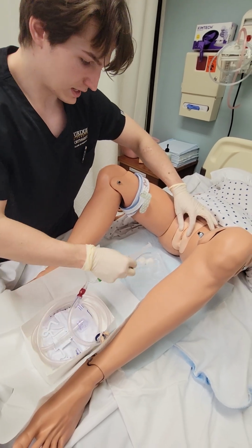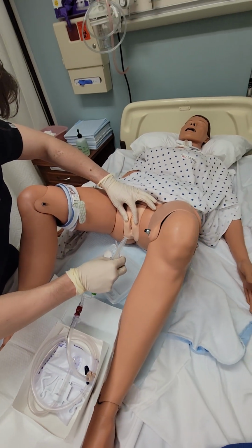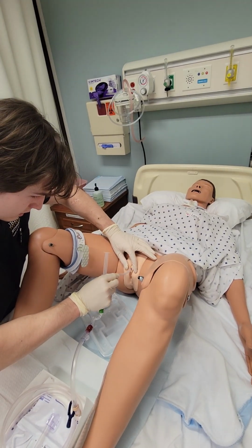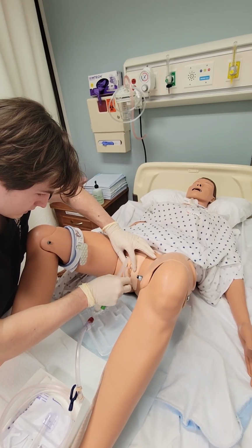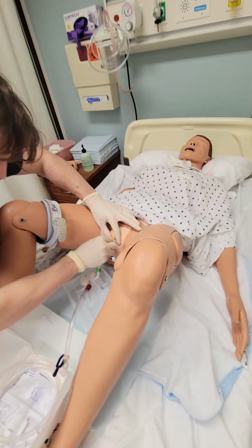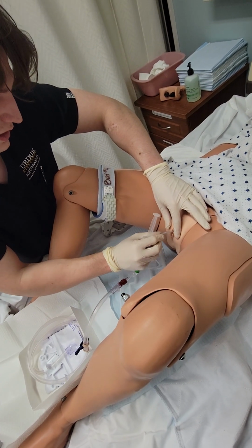Okay, so now insert this. It's a little lubricating jelly, about 1 to 2 inches, since this is a female patient. All right, now I'm gonna try spread these a little extra. Sorry for the discomfort. Right now I'm gonna insert it. There it goes. All right, so I'm gonna insert it until I start to get some urine return. So let's say I'm getting urine return now. I will then insert it another couple of inches in.